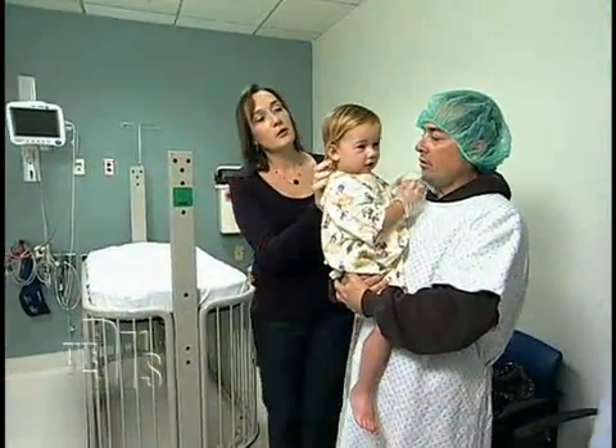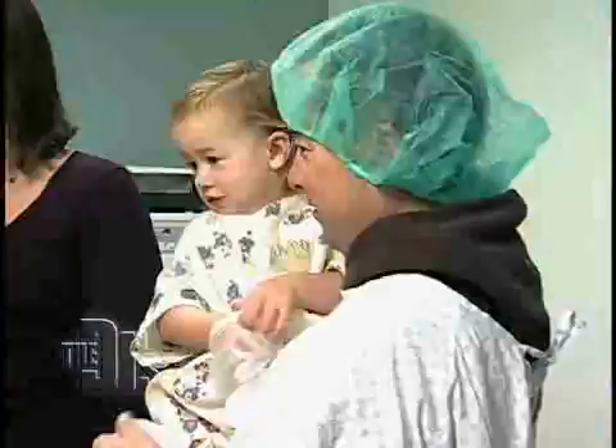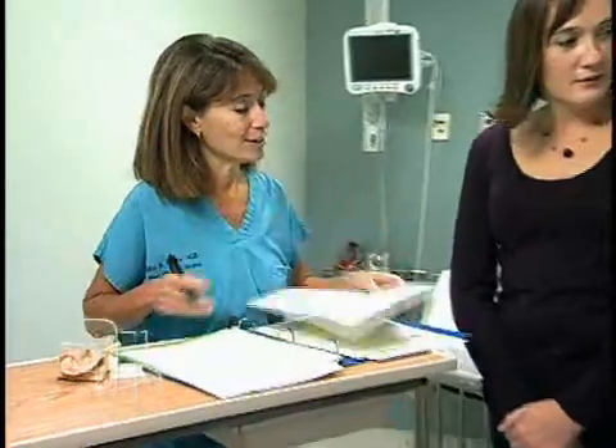Jennifer took Madison to Dr. Nina Shapiro for a simple procedure that could reverse her painful condition. It's okay, baby. Good morning. How are you guys doing? Good to see you again. We are gonna get rid of these ear infections for Ms. Madison here.